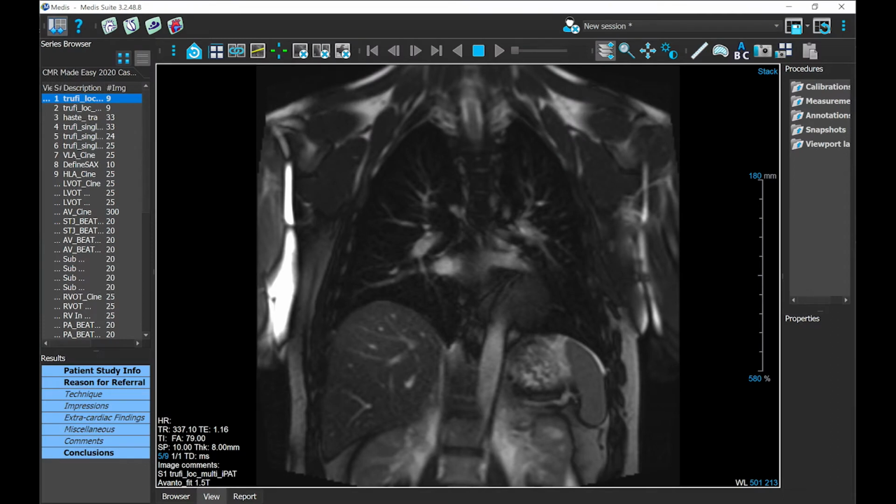Case 7 is a 33-year-old gentleman with an underlying diagnosis of PDA, aortic coarctation, and VSD. In 1985, aged 3 days old, he underwent a subclavian flap repair of the coarctation, PDA ligation, and PA banding. The following year, he underwent VSD closure with reconstruction of the PA.